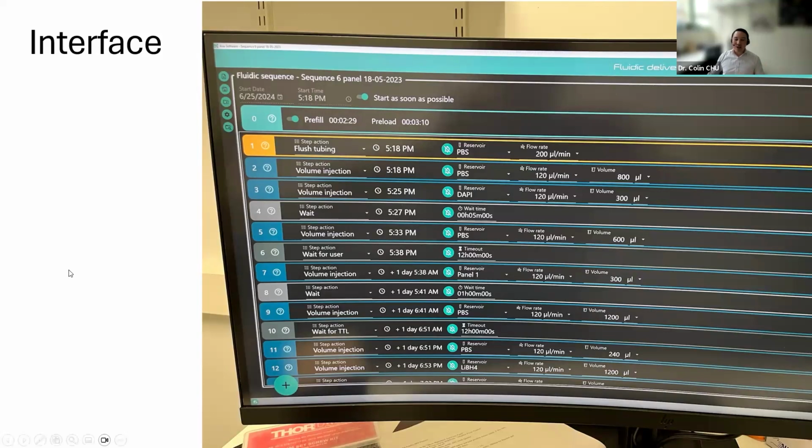So certainly the students really love this because it can increase their efficiency, so that they then have most of the day free. It's not taken up with taking slides on and off, and also I would argue that in some ways it would make your imaging even more reliable, because the alignment is even easier because you're not taking it off the microscope.